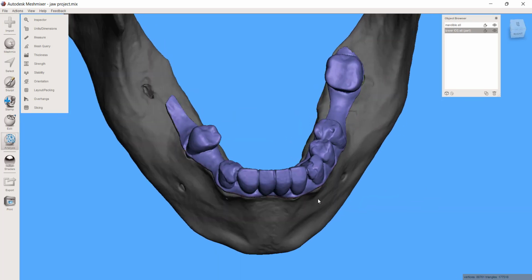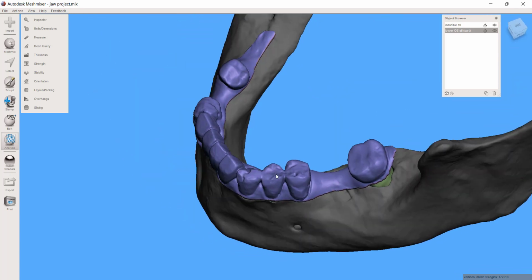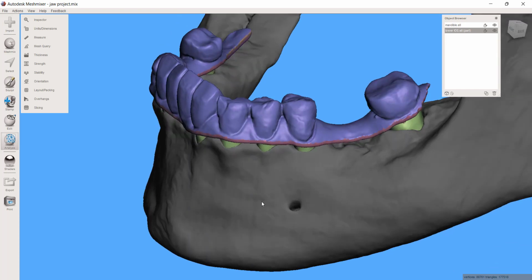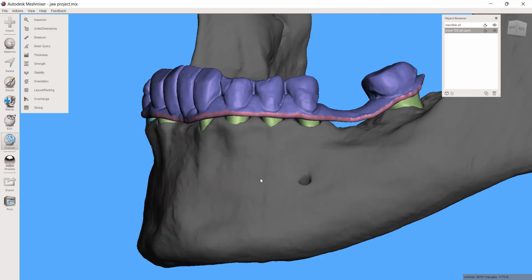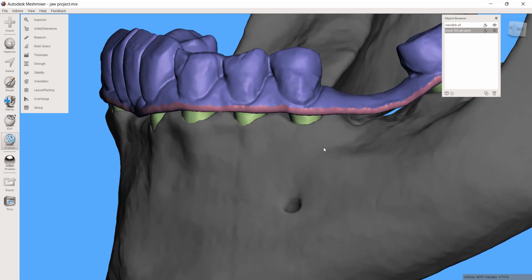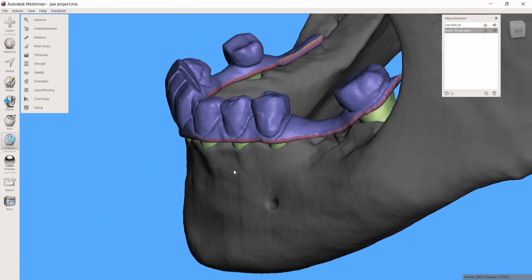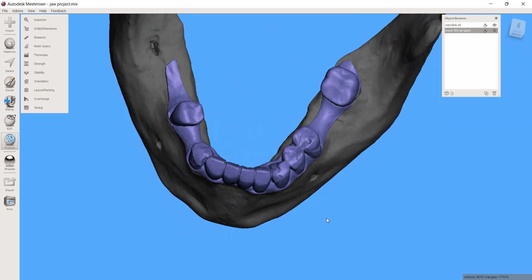All right, so here was my thought when I was trying to think how they could make some really nice lifelike models. It would be nice if they could print this jaw out of something in bone that would be soft enough to drill through without chewing up your drills. But one of his requests was I'd like to be able to see those roots, so that they get an idea of where the adjacent anatomy is, so that they can appreciate that when they're setting up their angulation and everything. So we'll go through some of that later.